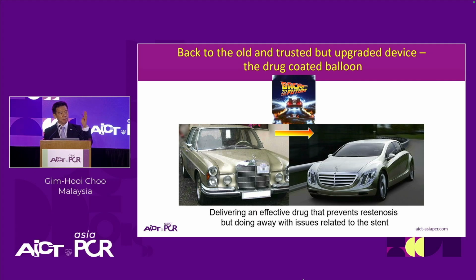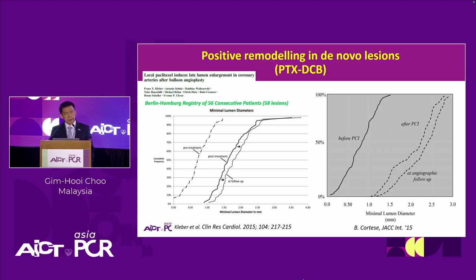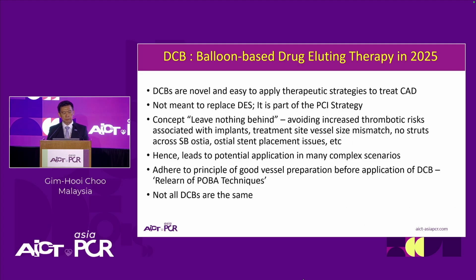It's an effective way to deliver the drug to the vessel wall, but without leaving anything behind. Because of the mantra, you want to have nothing behind. So that's a good concept. And we know without caging the vessel, with the drug-coated balloon, with paclitaxel-based delivery or therapy, we can have positive remodeling of the vessel.